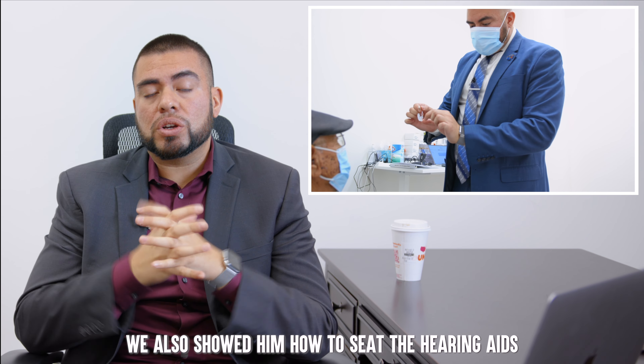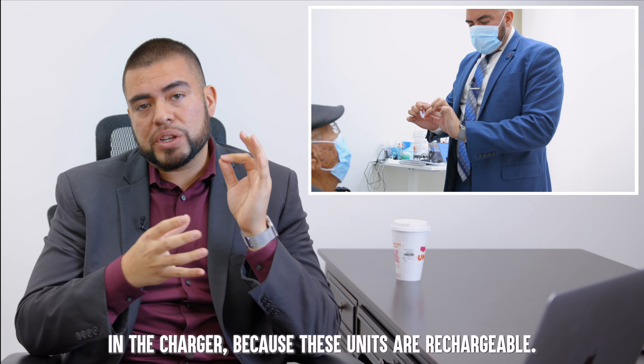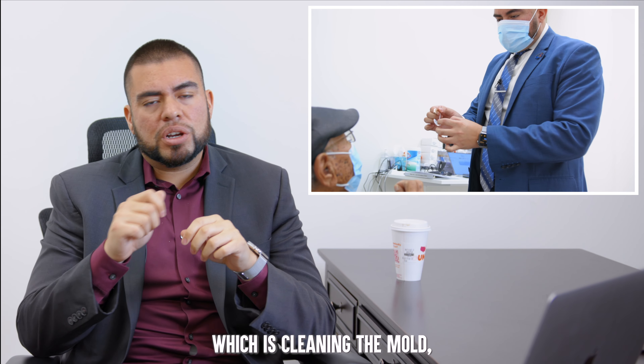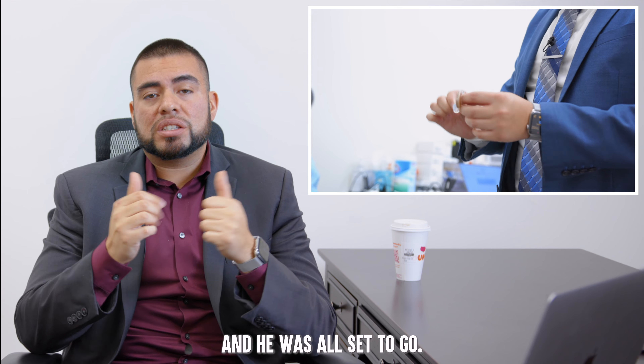We also showed him how to seat the hearing aids in the charger, since these units are rechargeable. And of course, we covered the basic cleaning and maintenance — cleaning the mold, brushing off any debris around the instrument — and he was all set to go.